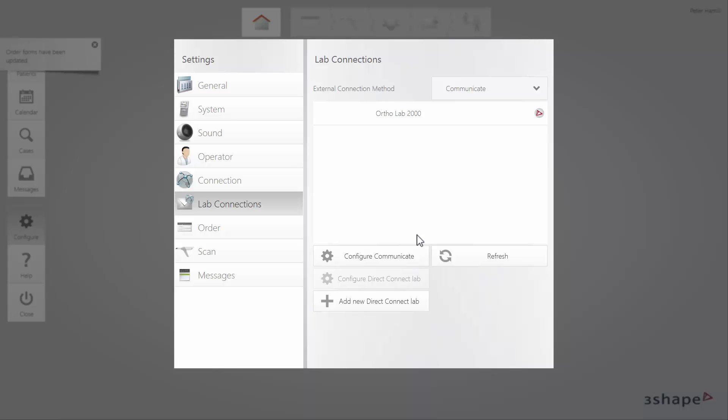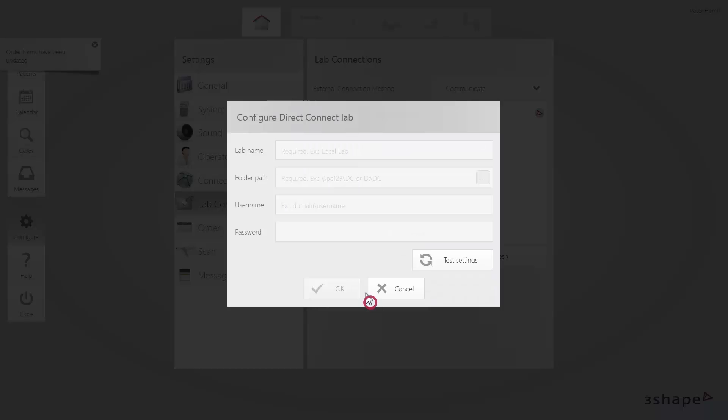To configure the Direct Connection via Direct Connect, you need to click the Add New Direct Connect Lab button. Fill in the lab name and folder path, which will later be used for file exchange.